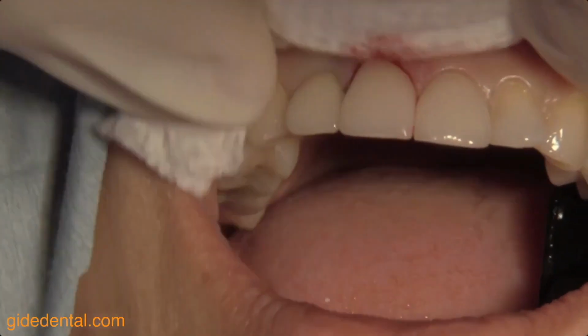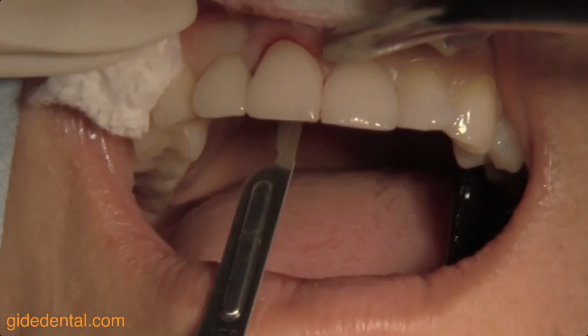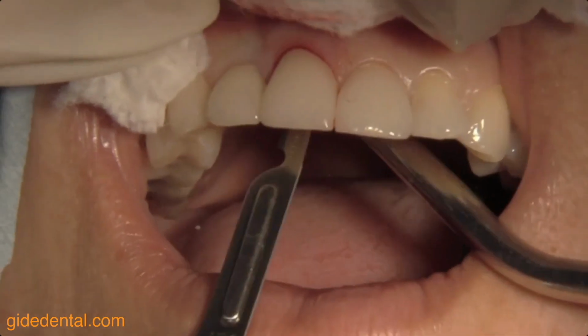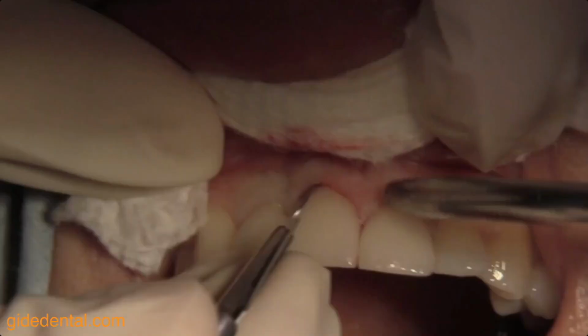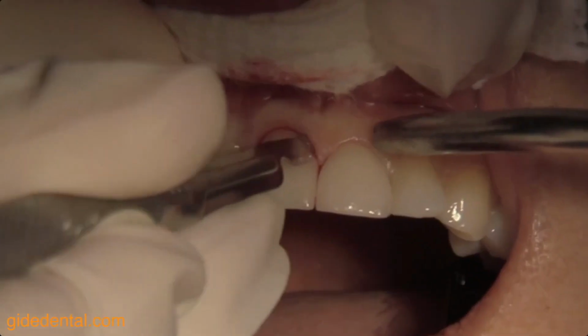The patient has received for anesthetic a pretty simple treatment, which is local infiltration anesthesia, and for this patient I use Septicaine. She has no allergies, healthy, non-smoker, and no periodontal disease. Here's the cut, again, that's going through the sulcular and gently separating the fibers that we have here.